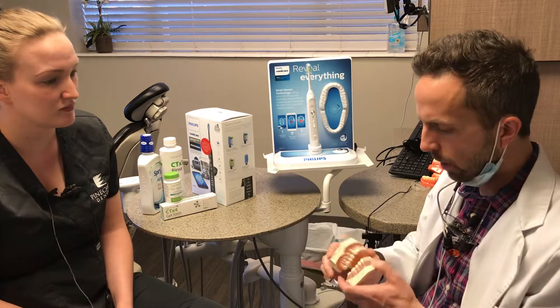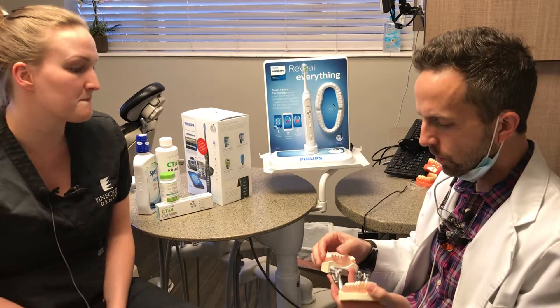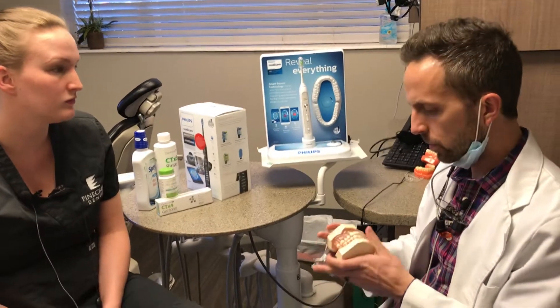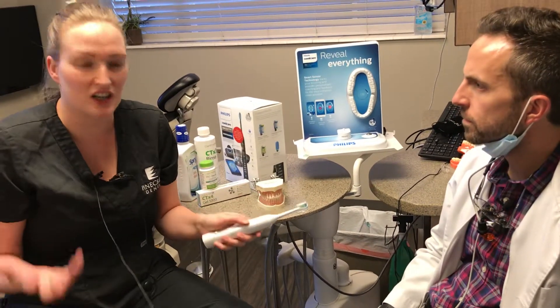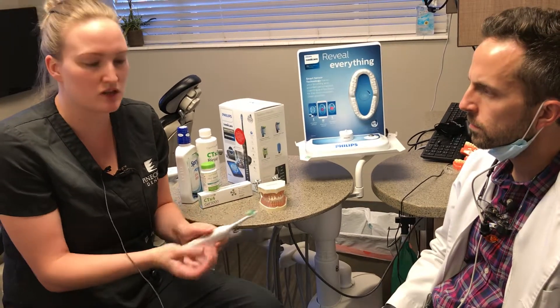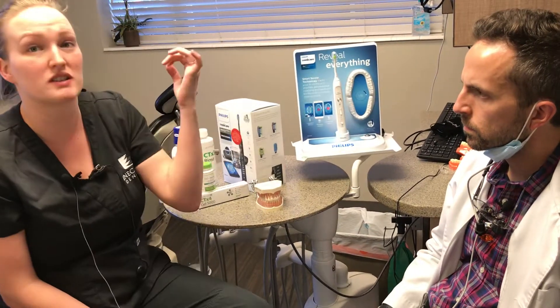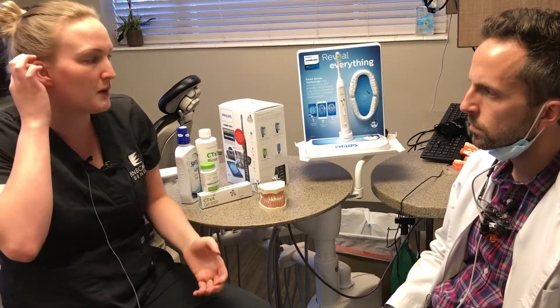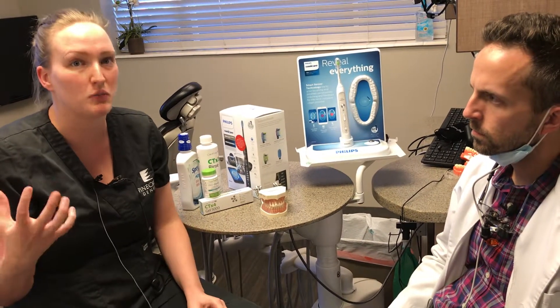If someone has been using a manual brush, what would they expect to feel differently, and how does it work around crowns, caps, root canals, implants, and bridges? The Sonicare uses sonic vibration — that's why it's called sonic — so you'll hear and feel a difference compared to a manual toothbrush. The bonus with the vibration is that it forces toothpaste to go around your crowns and down by your implants to keep everything clean. It's also gentle on implants, crowns, and bridges, so they'll stay clean and last long-term.